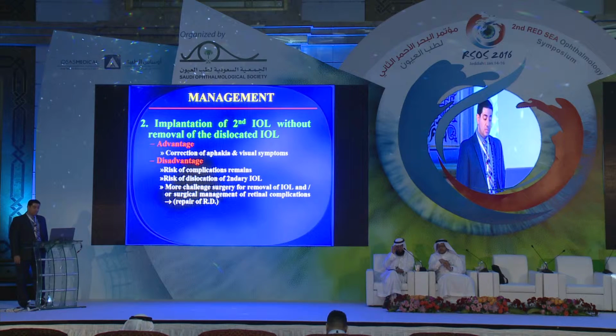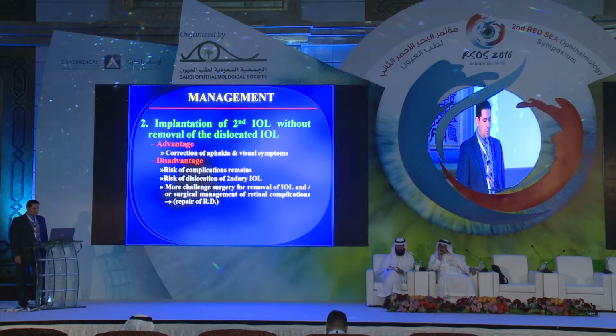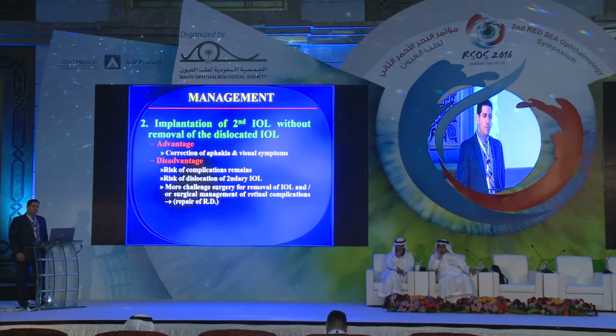Number two, implantation of a second IOL without removing the dislocated IOL. The only advantage is correction of aphakia and visual symptoms. The disadvantages: the risk of complications still remains, there is a risk of dislocation of the secondary IOL again, and it is also a more challenging surgery for removal of the IOL or for any retinal complication.